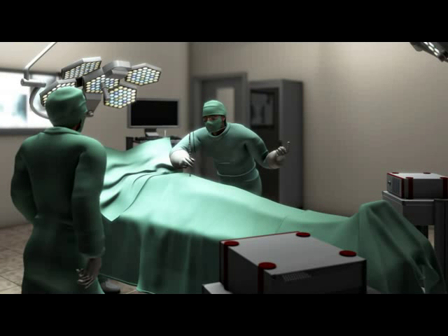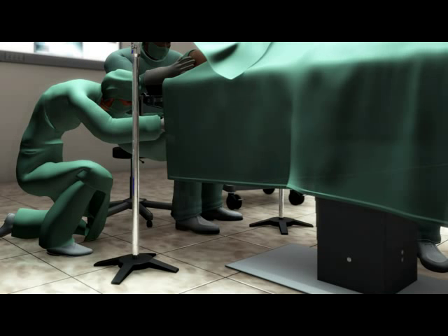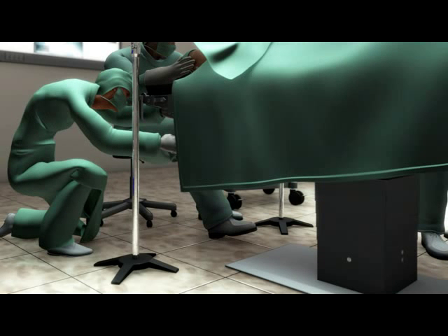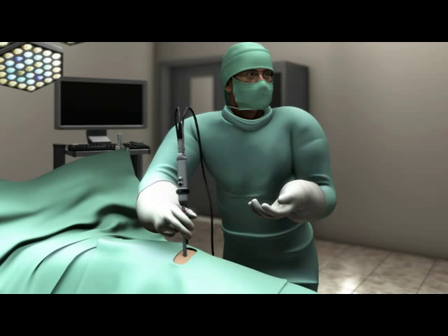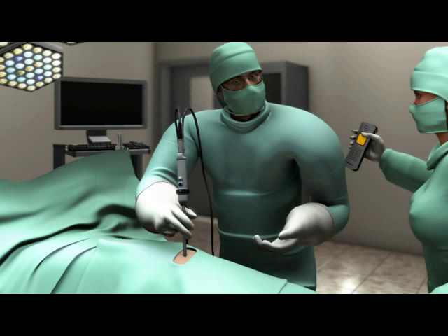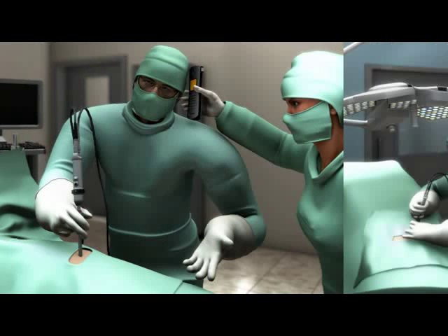The position also has to be changed in the standard operating theatre. Unfortunately, the remote control is still missing. All of a sudden, the surgeon discovers a problem. A colleague has to be consulted. The surgeon attempts to describe the findings by phone.